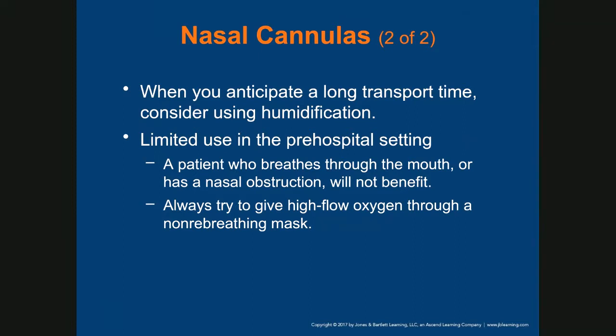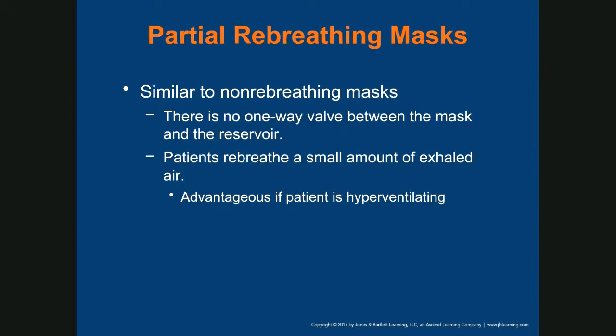And as I say, if you're going to keep the humidifier on the cylinder, please, for God's sakes, clean it. I have seen quite a few humidifiers that I am terrified for those patients in the hospital setting. Dirty, right? So make sure it's clean, as you can have a patient with pneumonia in a couple days.